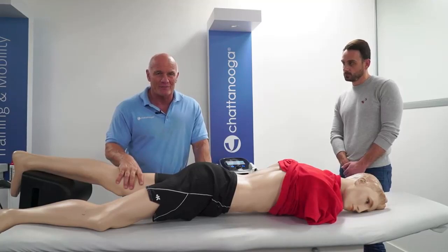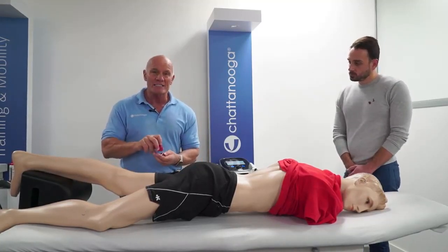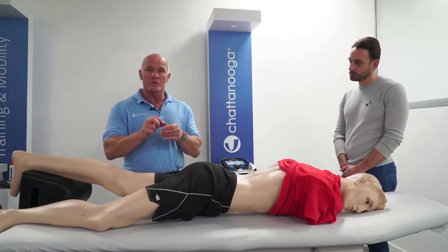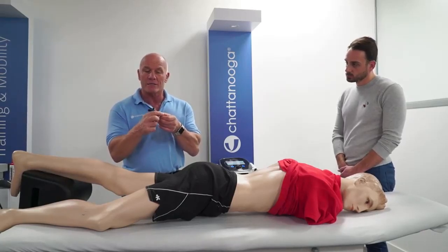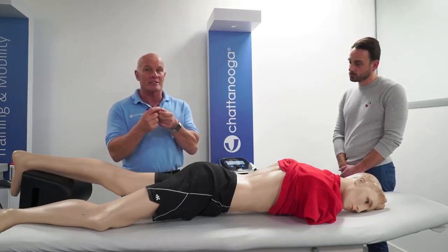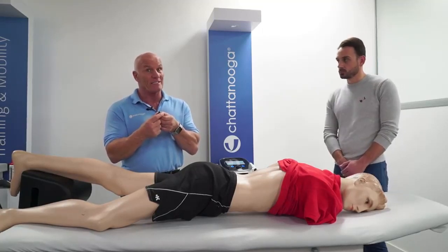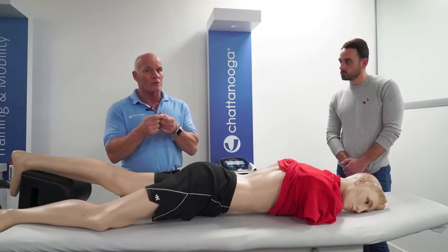So there's not a set number. Every time that you clean it and check the back and look for that good, the bad and the ugly side, when it starts to get bad, then you need to start thinking about changing it. The ugly you definitely need to change, because the energy coming out of that transmitter is not what the manufacturers had intended it to be.